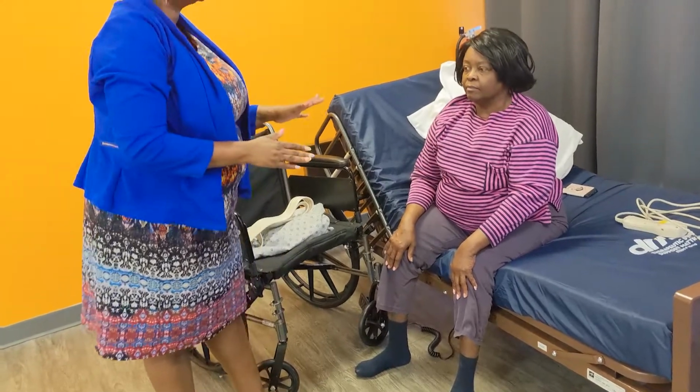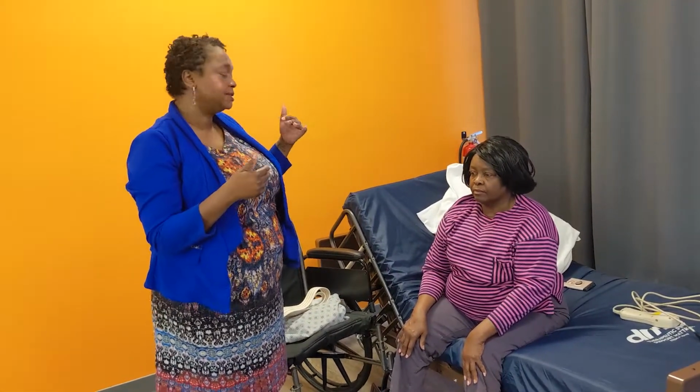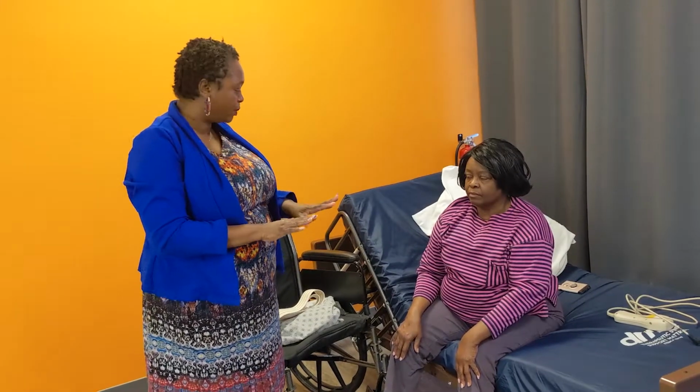And so what we're going to do here is called a dangle, all right? I'm going to ask her 2 specific questions. Do you feel dizzy or lightheaded? No. Okay, and so it's not, are you okay? It's actually dizzy or lightheaded, because you want to make sure she's not suffering from orthostatic hypotension, which is when someone goes from lying to standing and their blood pressure drops all of a sudden, okay?